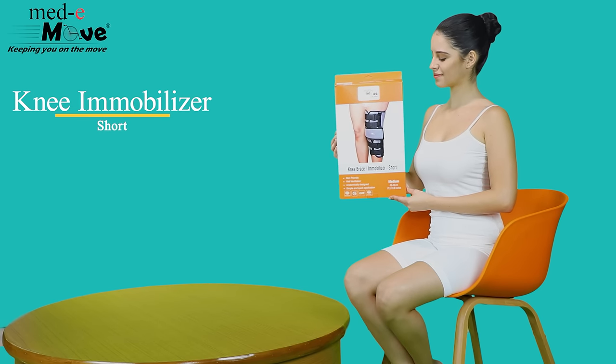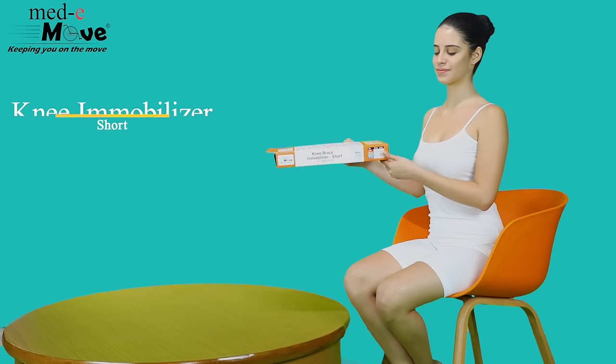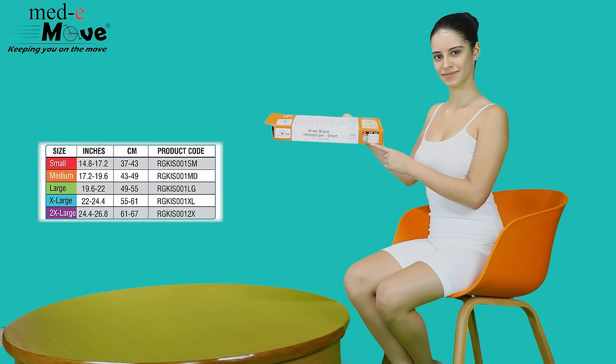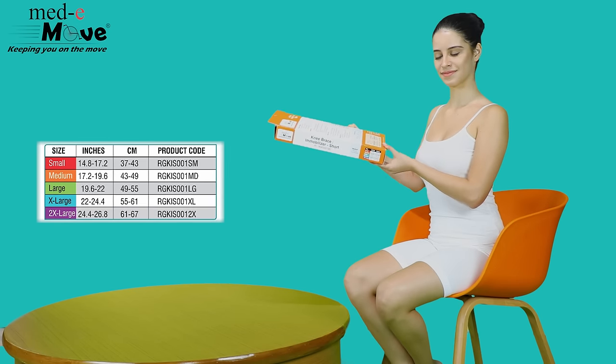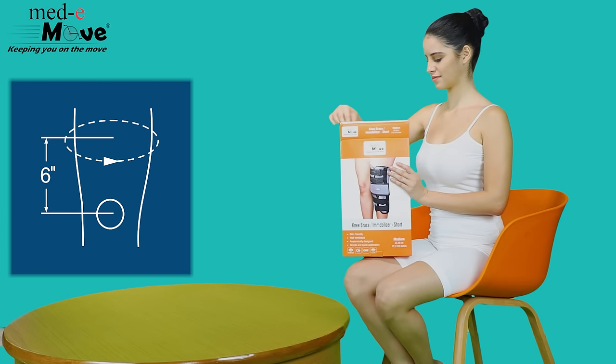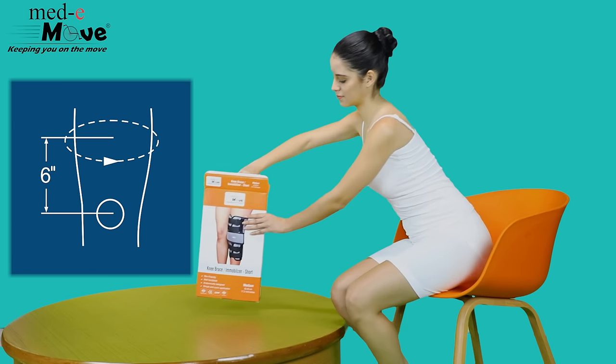Here we will demonstrate how to measure the size and wear the Medimove knee immobilizer short. The knee immobilizer short is available in 5 sizes. Measure the circumference around your mid-thigh approximately 6 inches above the knee joint and refer to the chart printed on the box.